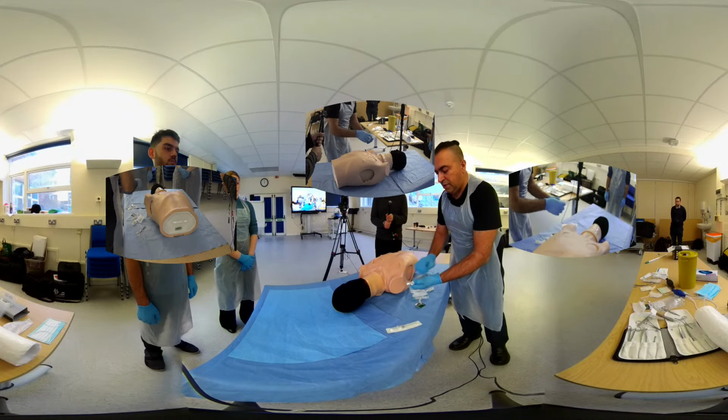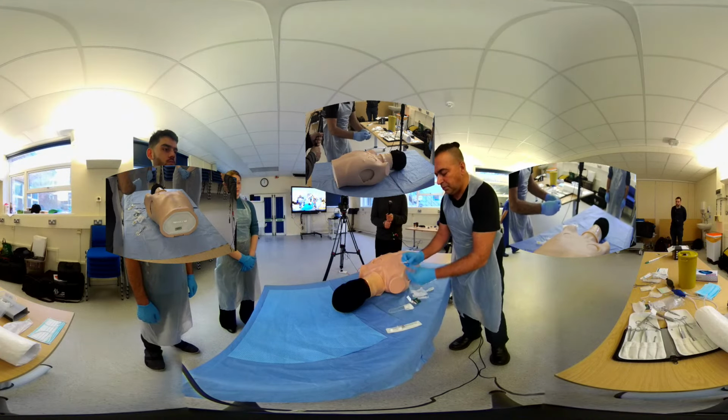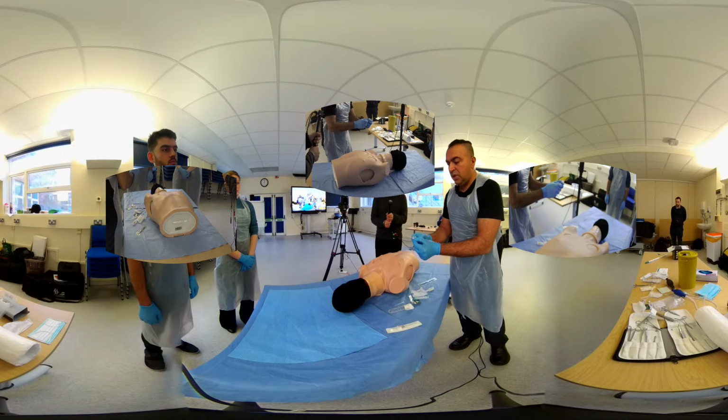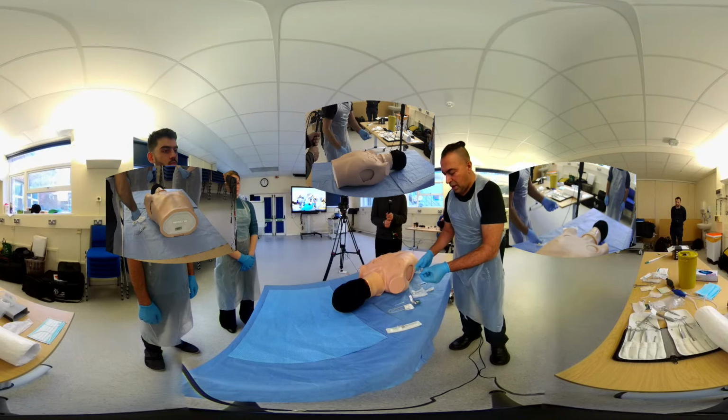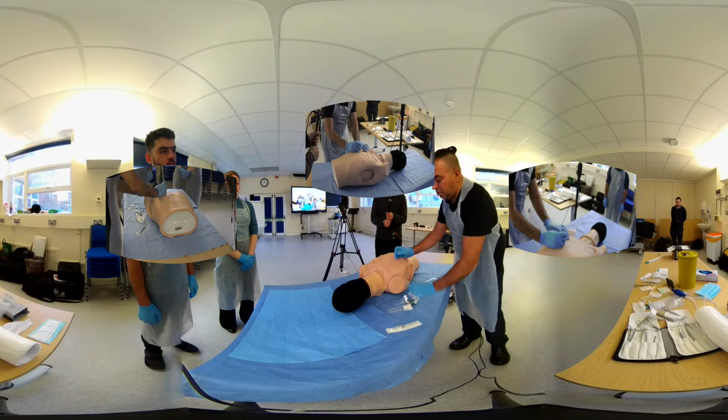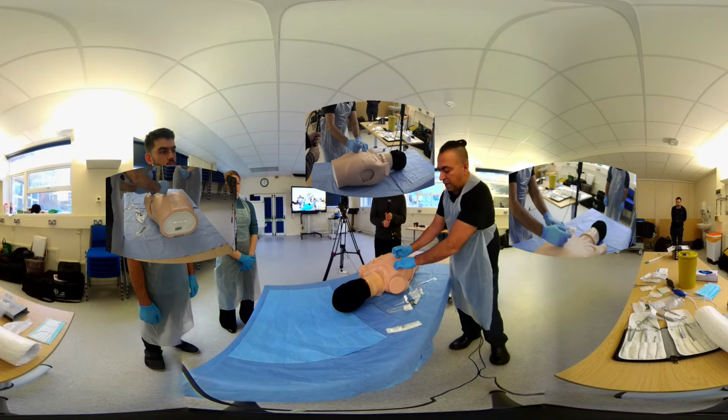You've got your Venflon here. You take the cover off, and you've got the sheath, and you've got the metal spike. Take this bit off as well. And then you would put it into the space that we talked about.